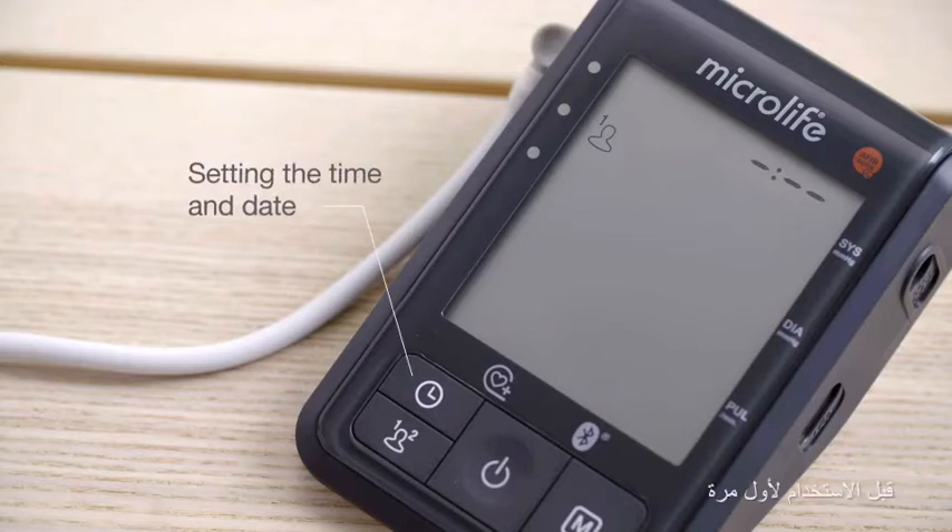Before using it for the first time, we recommend that you set the time and date, enabling you to retrace your readings later.